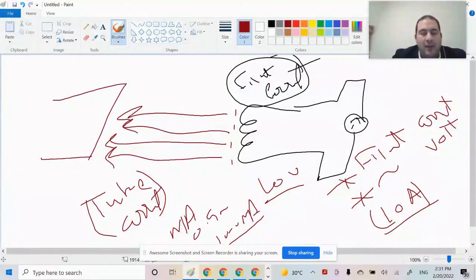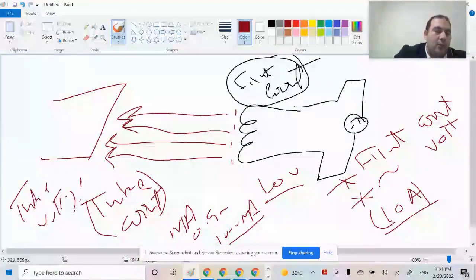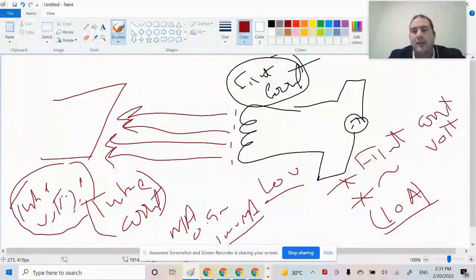The current that moves the electrons from the cathode to the anode is driven by the voltage that I apply as a potential difference between the cathode and the anode, which I call tube voltage. The tube voltage is my kilovolt value, which can be 20, 30, 40, 50, 120, or 140 kilovolts. The function of the tube voltage is to provide kinetic energy, thus controlling the energy directed towards the electrons and the energy of the X-rays produced.